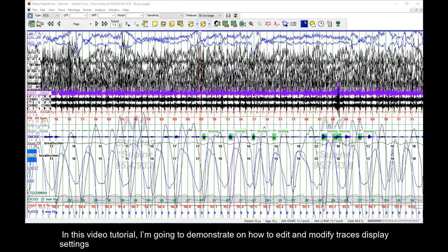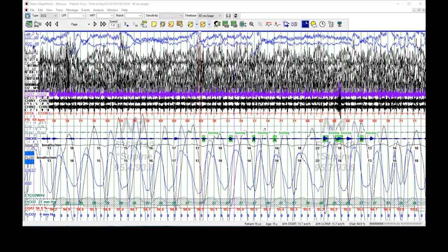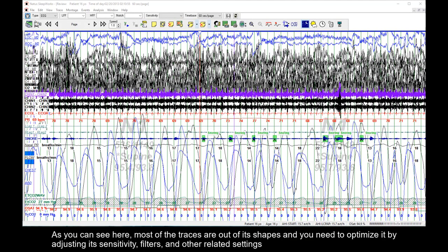In this video tutorial, I'm going to demonstrate how to edit and modify the traces display settings, so that you can create and save it to suit different user preferences. As you can see here, most of the traces are out of shape, and you need to optimize them by adjusting sensitivity, filters, and other related settings.